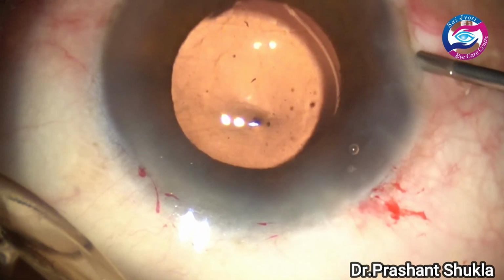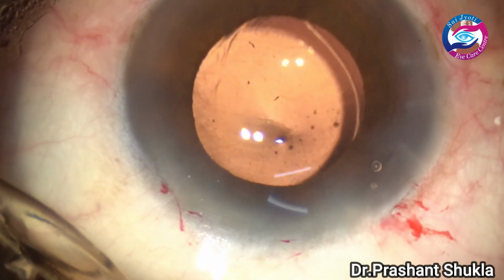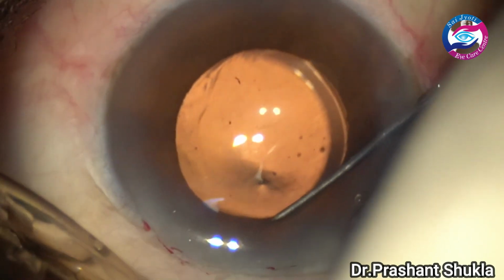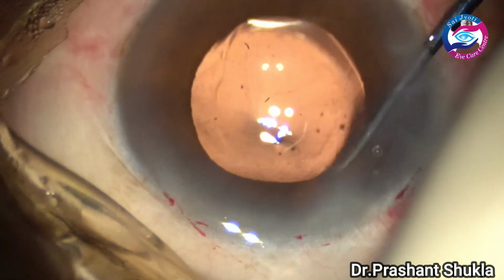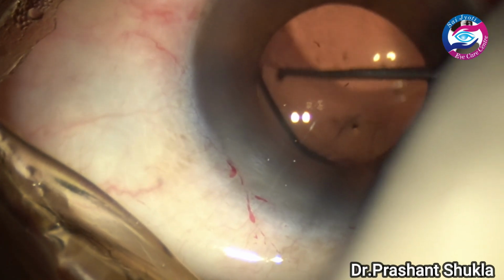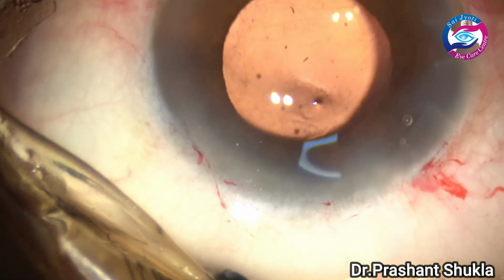It was found that one haptic was in the sulcus and the other was in the capsular bag. So I have planned to dial the haptic which is in the sulcus into the capsular bag, and as soon as the haptic goes in the bag, we will see that the lens centers on itself. Just in a moment, this haptic goes into the capsular bag and now the lens is well centered.